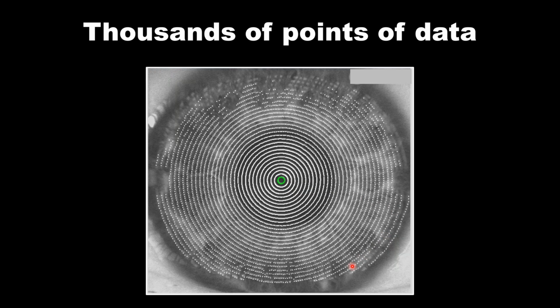All of those points are used to interpret the cornea's power, shape, and elevation, and that's therefore used in building the lens when we're trying to construct a 3D built contact lens. So all of these data points are important to us.